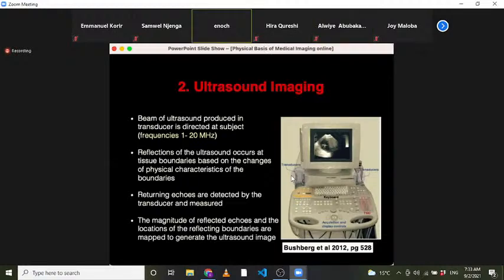Part of the ultrasound beam that has been sent in will be sent back as an echo. This echo comes back in the form of mechanical energy, and upon reaching the transducer, it sets it to vibrate, generating charges on the surface. These charges are picked up, and the electronics of the ultrasound scanner will use them to form the image.